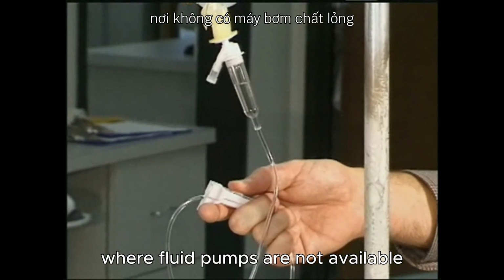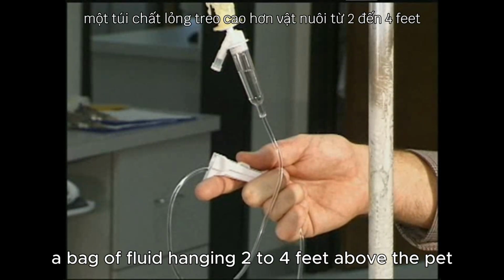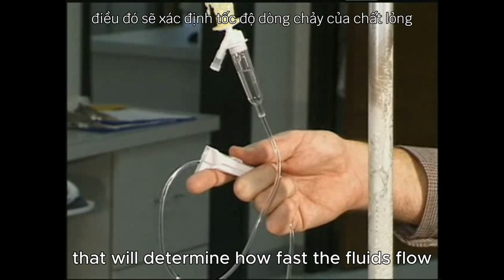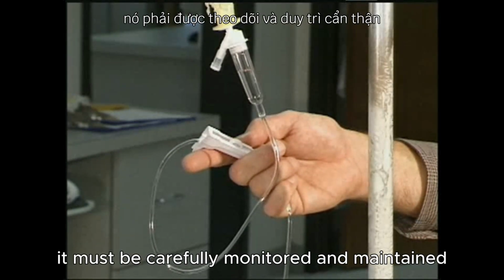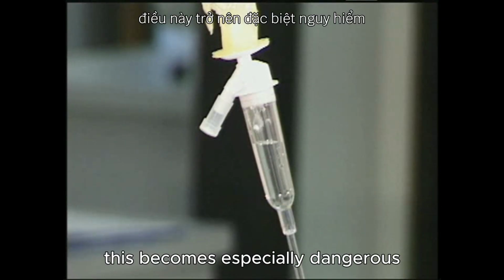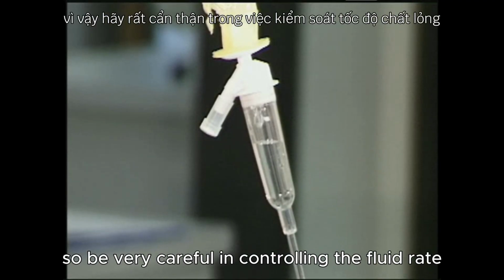Where fluid pumps are not available, gravity serves to push fluids into the ill patient. A bag of fluid hanging 2 to 4 feet above the pet will sufficiently propel the fluids. There is a flow rate valve that will determine how fast the fluids flow. Once this rate has been determined and set, it must be carefully monitored and maintained, as the animal's position will greatly affect the flow rate. This becomes especially dangerous if too much fluid is given to the patient. Too much fluid can easily result in death, so be very careful in controlling the fluid rate.